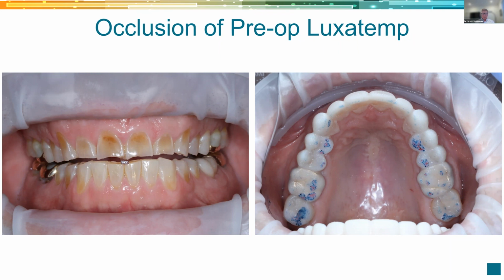Many of us have done this, and the patient's biting all over the place. We don't know where the jaw wants to go. That's not a fun day. So it's all about starting with the end in mind. And this puts a smile on my face when I see this.